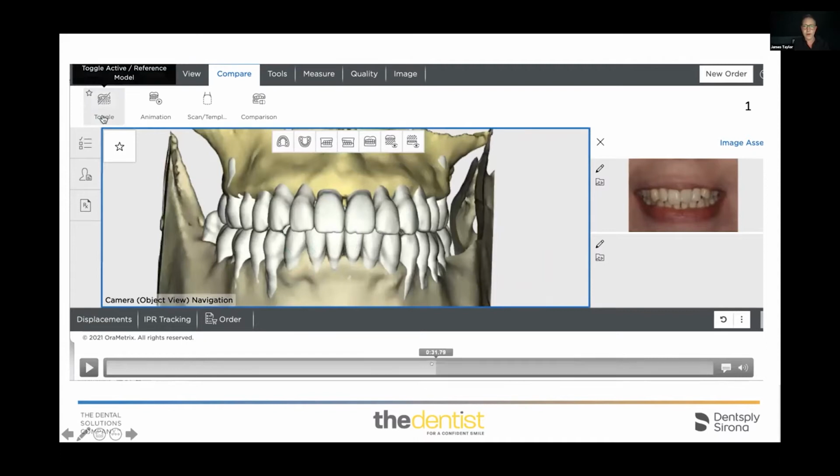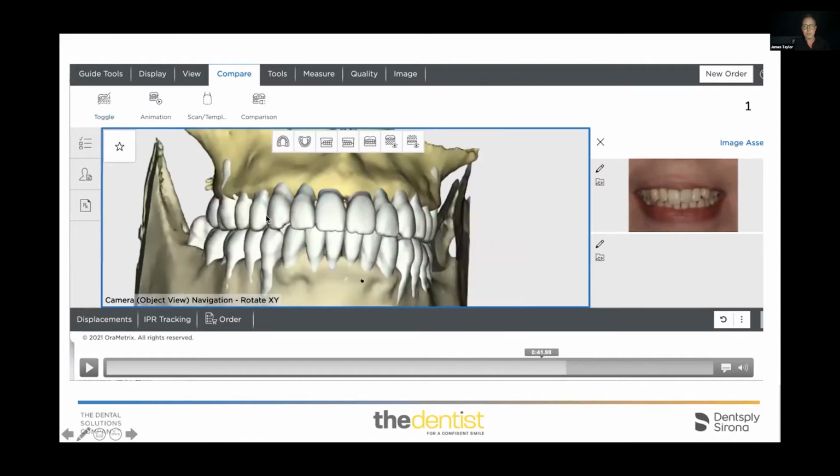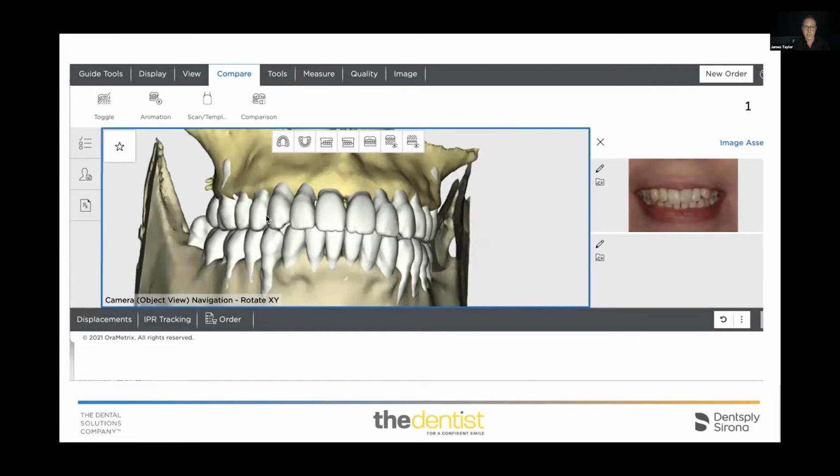if I can see where I was, look at the position of the teeth. She's very proclined in upper and lowers, and the risk of recession here is extremely high. And if nothing else, I'm going to pop those teeth into a much better position within the bone, and hopefully mean that I'm going to reduce the risk of any recession long term, as well as improving the way her teeth look.